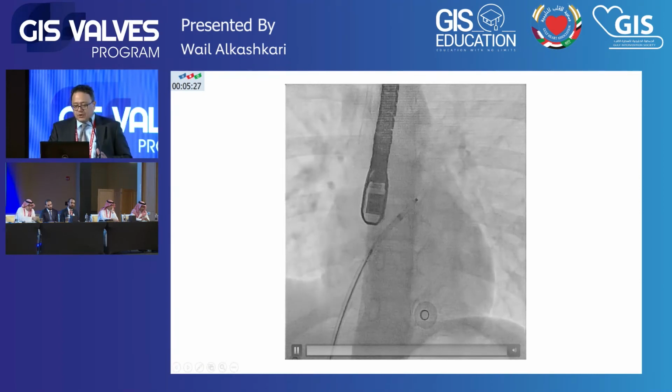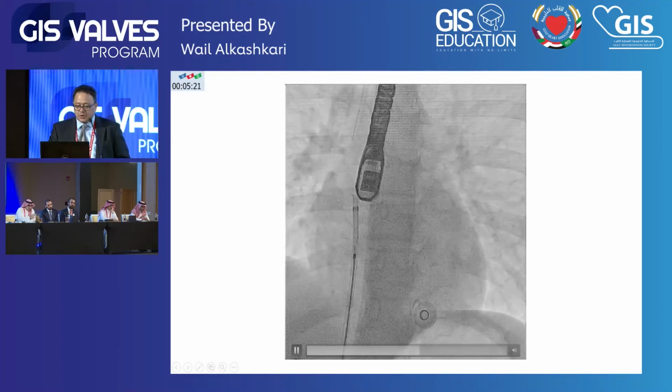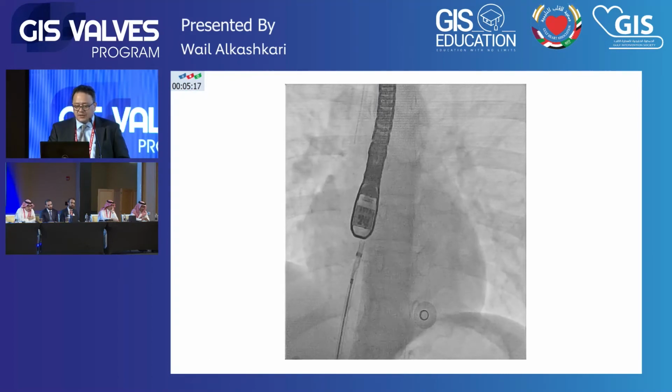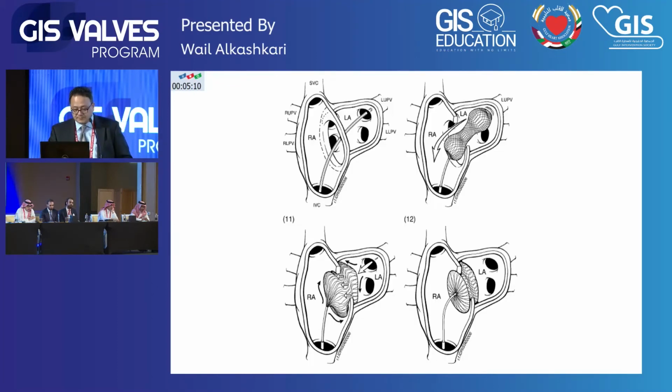So that's the usual one. Now I do clockwise, clockwise, clockwise. Sorry, it went back. So this is clockwise. Then I pull. I continue to unsheath. And then that's it. So that is the clockwise. That's the most common technique.